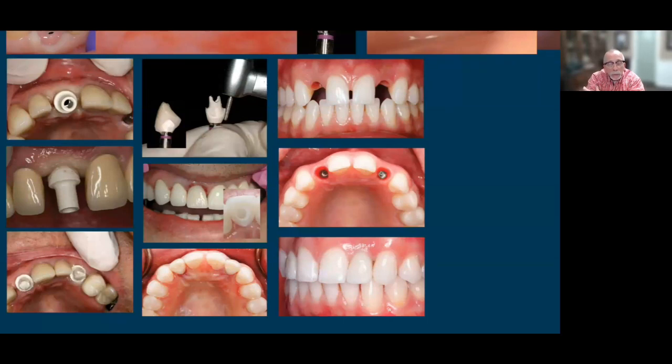You really want to have tissue engagement, right? The research has now proven to us that when we put something in an implant site, we want to have tissue engagement, meaning that whatever we put in there, we want to actually press into the tissue a little bit. And the general consensus is about a tenth, maybe two. It varies, and of course, it depends on the health of the tissue, but that means we're actually pushing against the tissue, which can be challenging at delivery, right? Because the tissue's fighting us, but it's really needed. If we don't engage the tissue with our restorations, then we see more tissue loss, right? But if we engage too much, we also see that tissue loss.